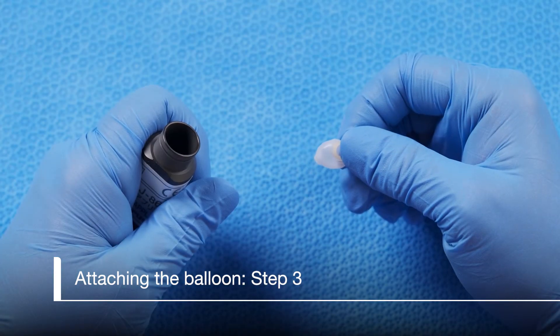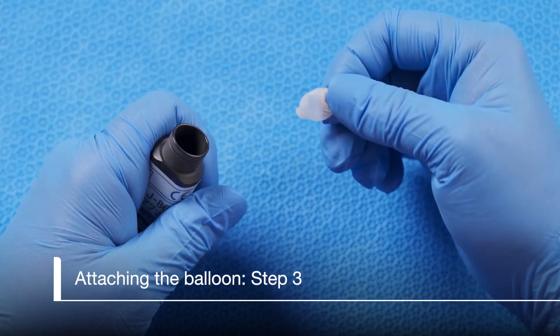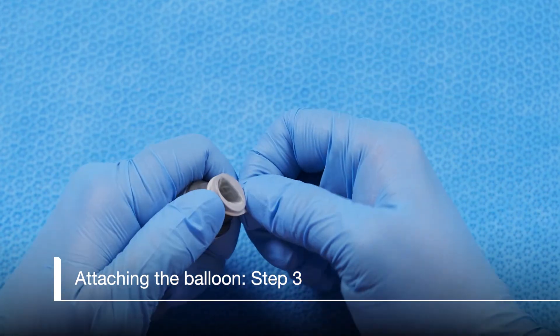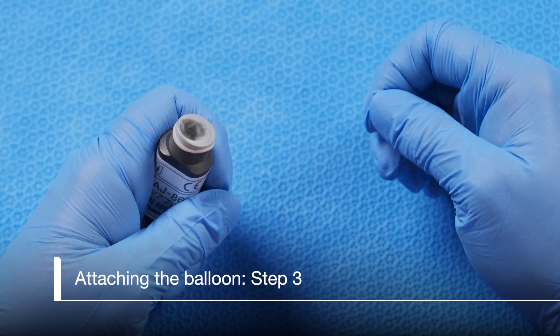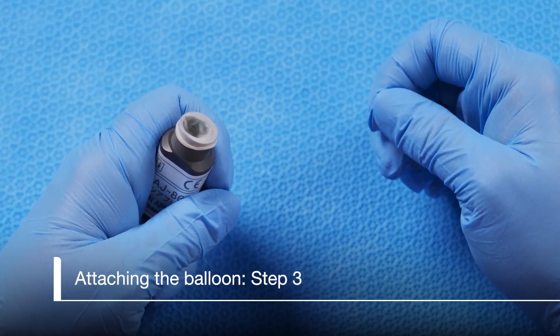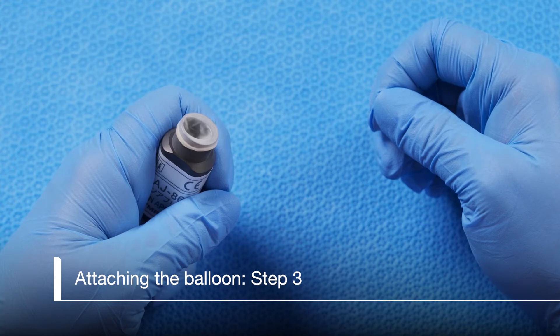To place the balloon on the applicator, hold the larger ring on the outside of the applicator. With the other hand, stretch the ring around the top of the applicator. Don't worry about any folds or rolls in the balloon — these will take care of themselves. It doesn't have to look perfect.